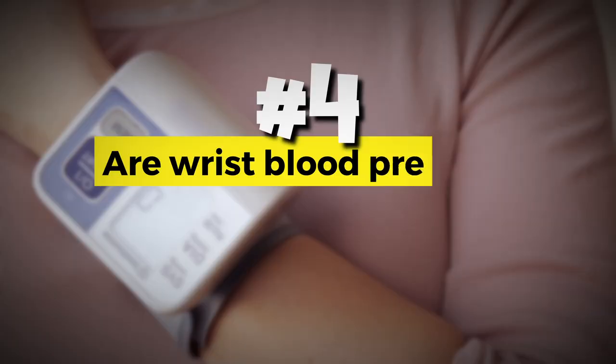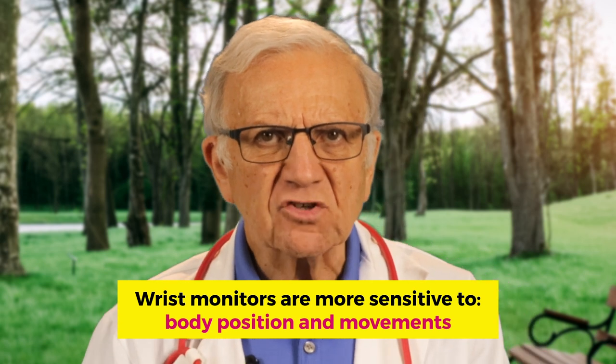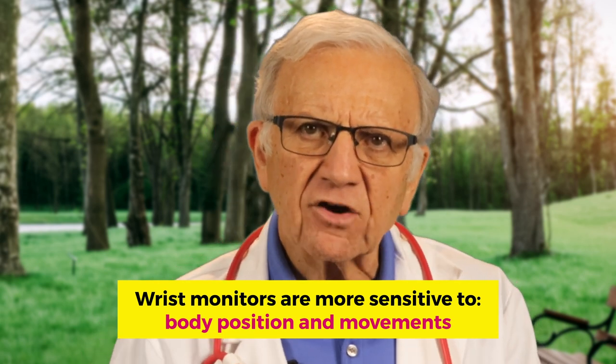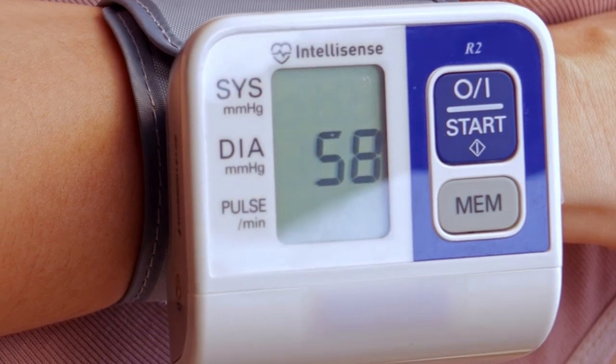Now let's address the elephant in the room: are wrist blood pressure monitors accurate? While they offer convenience, there are some drawbacks. Wrist monitors may be more sensitive to body position and movements, potentially leading to less accurate readings. Other factors such as obesity, age, and certain health conditions can also affect precision. It's crucial to be aware of these limitations to make informed decisions about your health.